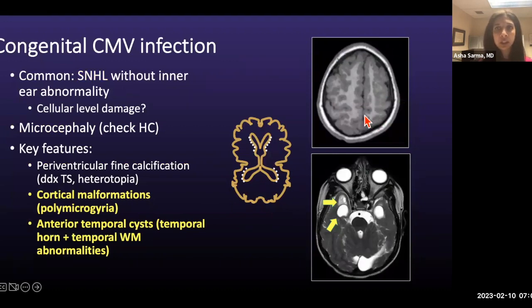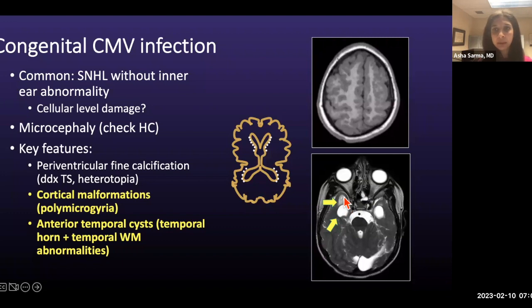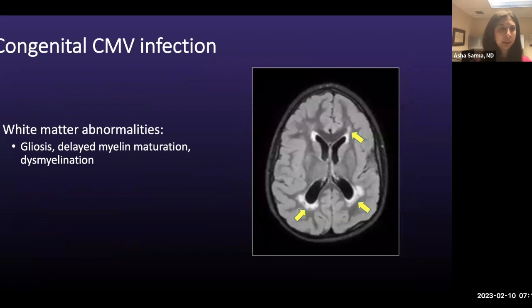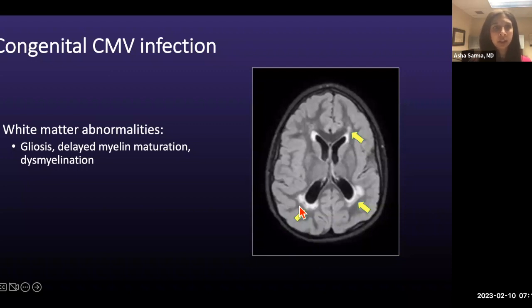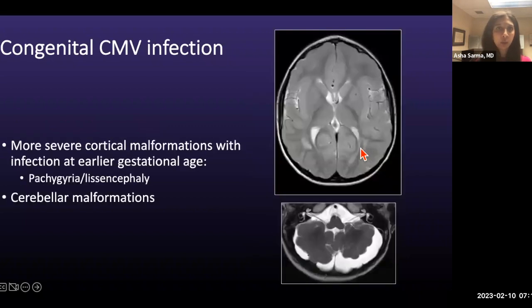Here you can see diffuse bilateral polymicrogyria — increased gyral frequency and abnormal sulcation. Another important finding is abnormalities in the anterior temporal lobes, such as white matter signal abnormality. You can see T2 hyperintense white matter with cysts, as well as dilatation of the temporal horns. The schematic helps us remember the abnormal sulcation with polymicrogyria and periventricular calcifications. Another common finding is white matter abnormalities such as gliosis or delayed/dysmyelination, with T2 prolongation in the posterior periventricular and frontal white matter.